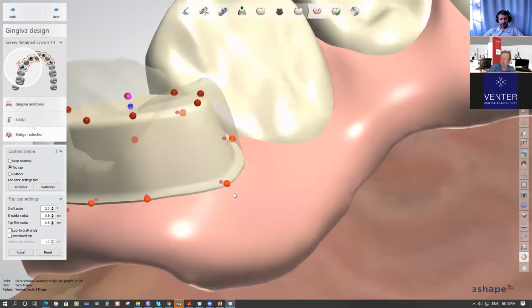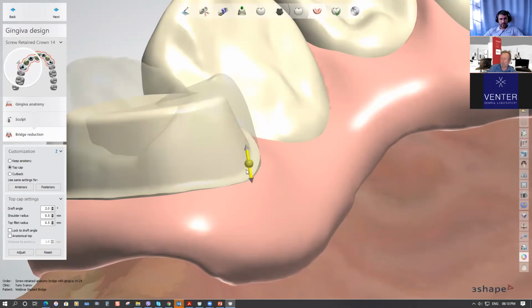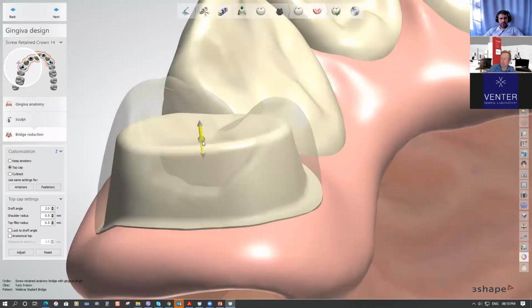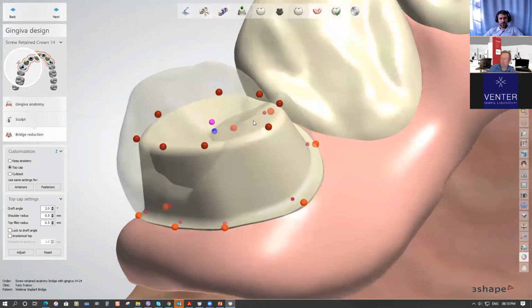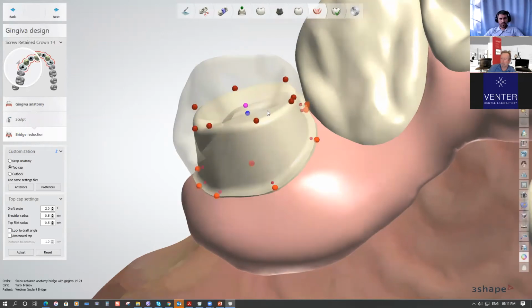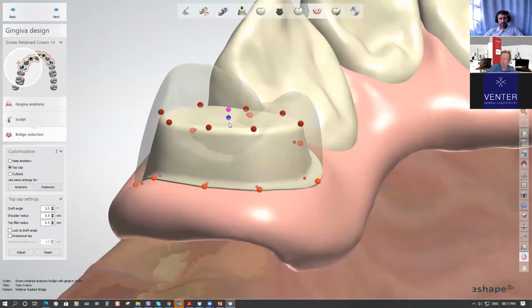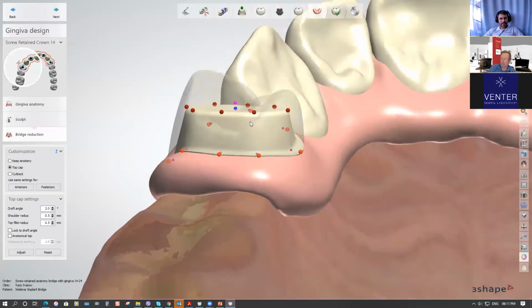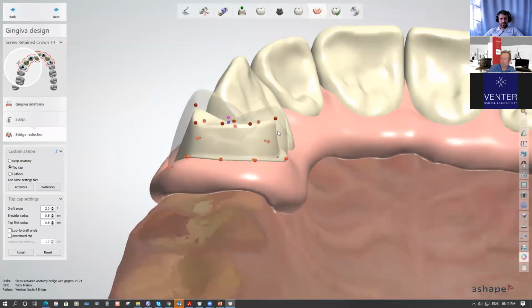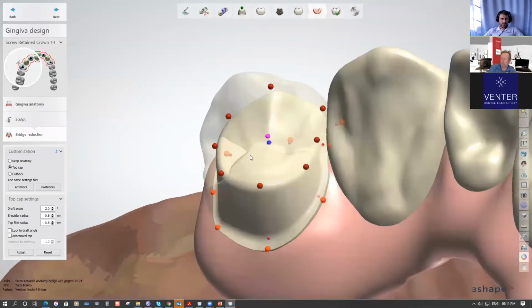rising up here. And we could pick up any dot, like an orange dot, and pull it up a bit, change the position of the margin by this dot, as well as change the position of the shoulder a bit with this pink one to increase it. And this is the area to work all around the margin, as well as we could choose to make some depression just in the middle of the tooth, the same way, pulling it down a bit with the brown dots here. We could pull down the whole piece also. It will look like a die. I could rise up some areas like this to create this kind of preparation.